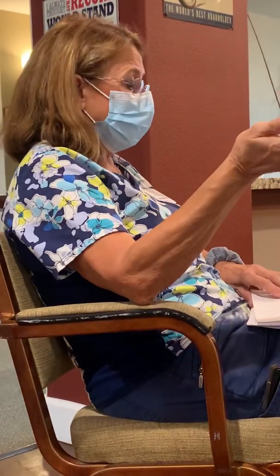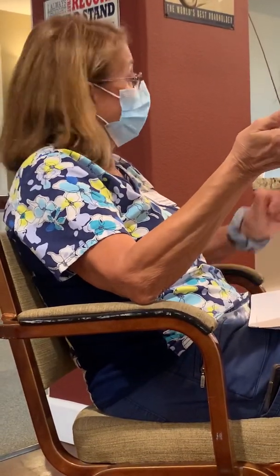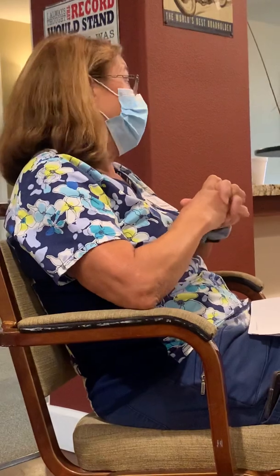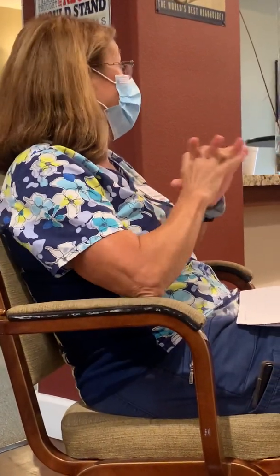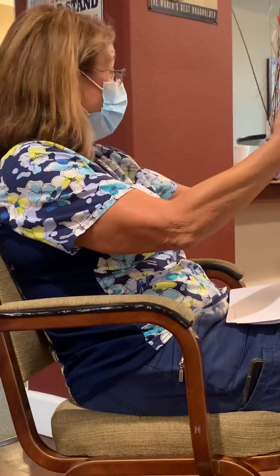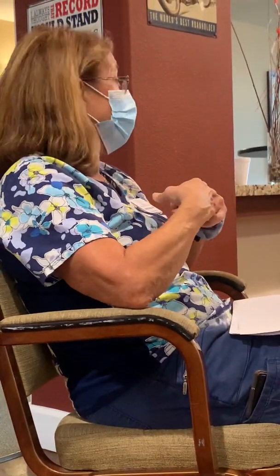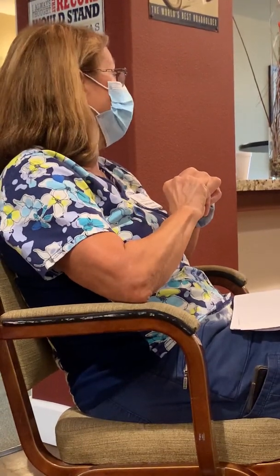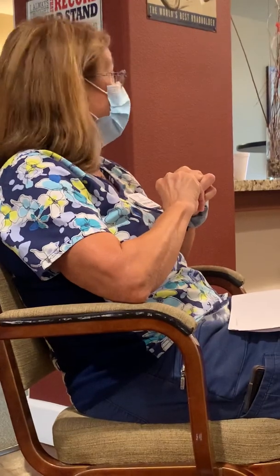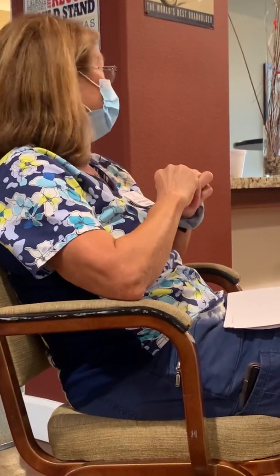Just make sure that you put absorbent chucks or briefs underneath the patient. Keep them clean as often as they urinate. And especially if they have a bowel movement, it's really important after they have that bowel movement. Even if you've done your peri-care that morning, if they have a bowel movement, you gotta do peri-care again, because they will get an infection. And E. coli is probably one of the most common causes of urinary tract infections, especially in women.